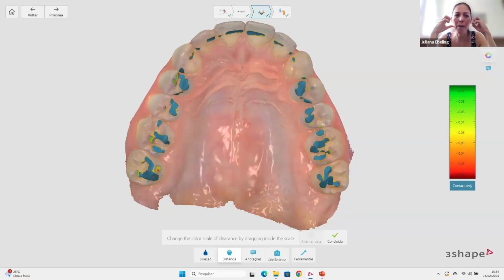I will have the maximum force, and this contact will happen when this muscle contracts. So here I consider 100, that is a more refined evaluation. And then here, when this patient makes force, I will have this contact happening.